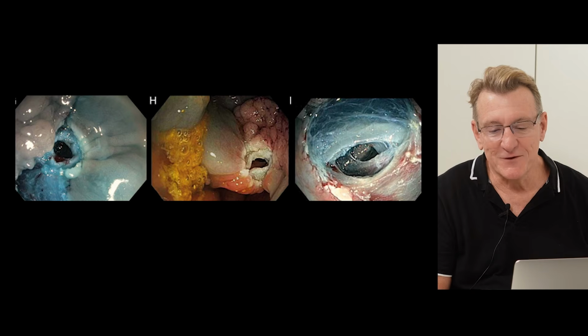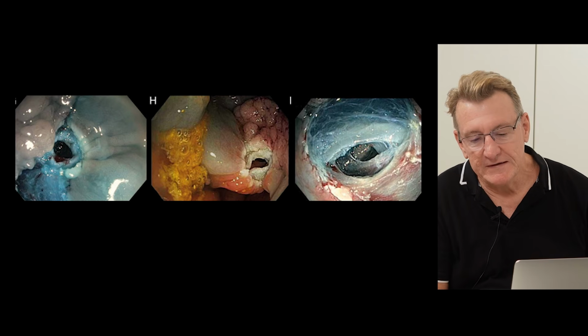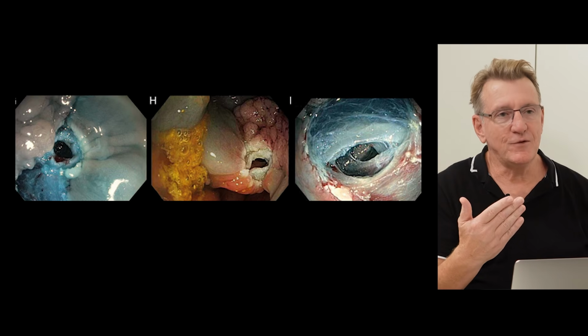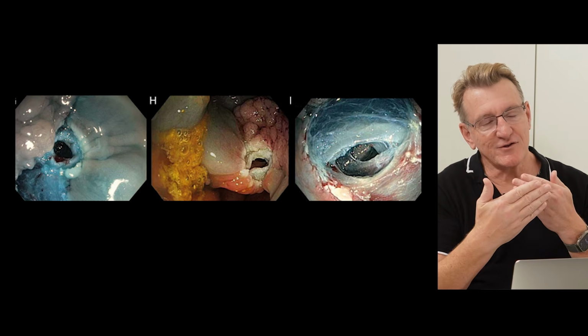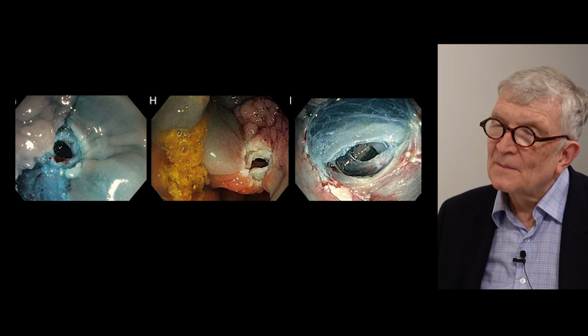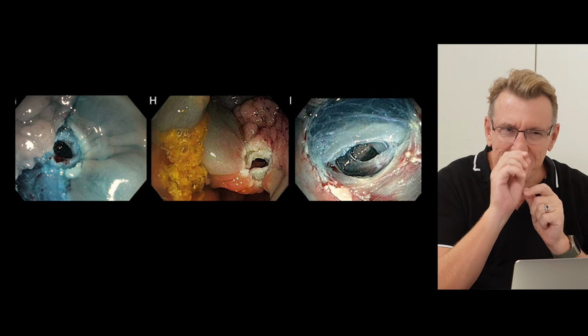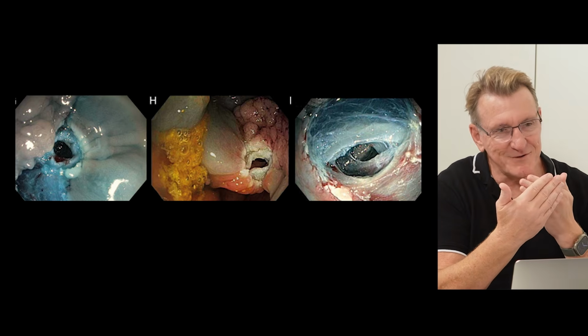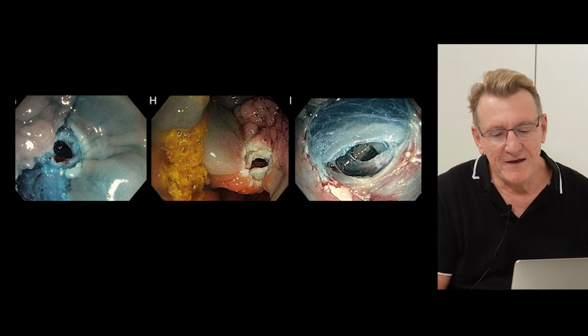Yes. Good. Now it gets easier because you see a hole. Yeah, correct. So type 4 is a visible hole. You can look through and you have a hole when you see another structure moving independently behind. This is because sometimes you look and you think, is that a hole? Even a tiny thing. But if you see something sliding independently of the luminal structures, there's a hole.